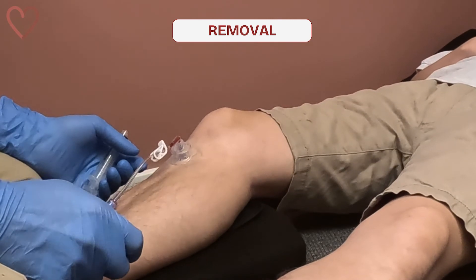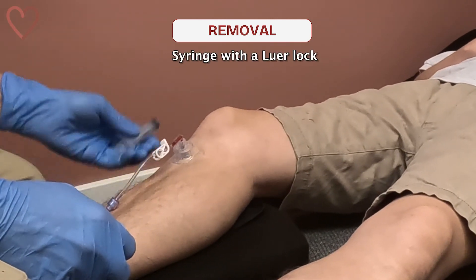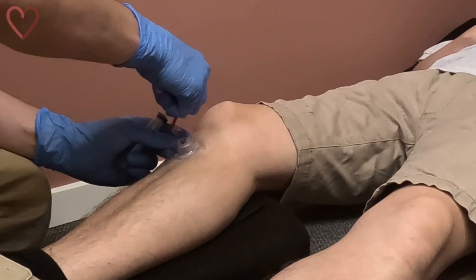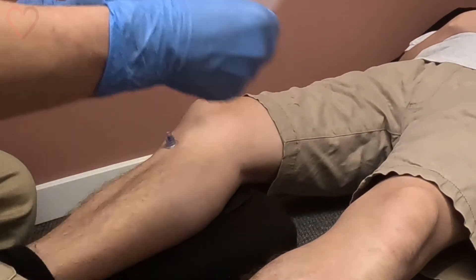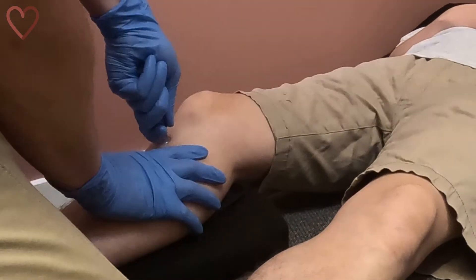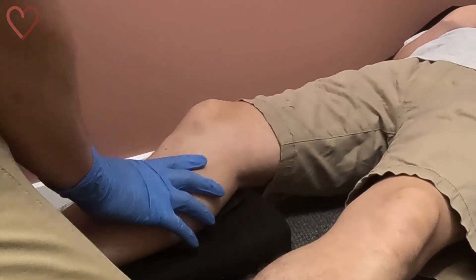When it's time to remove the IO needle, you'll need a 10 milliliter syringe with a luer lock. Detach the infusion tubing, remove the securing tape, and attach the luer lock to the IO needle with a smooth clockwise motion, then steadily pull to remove it.